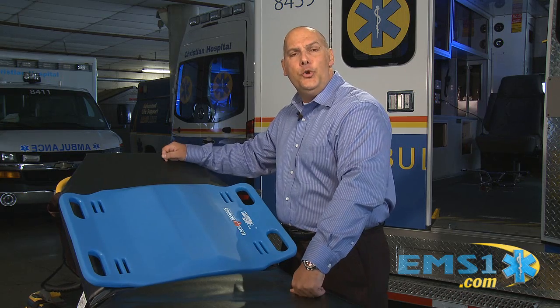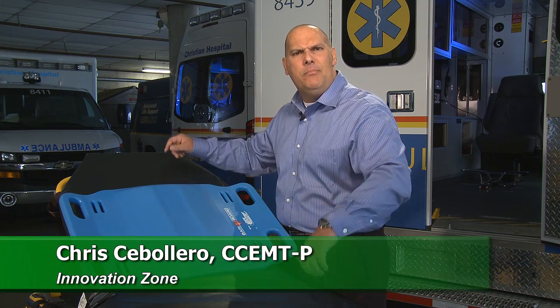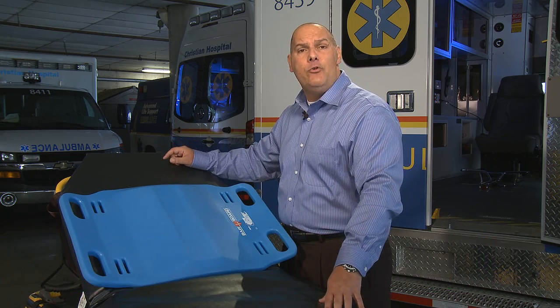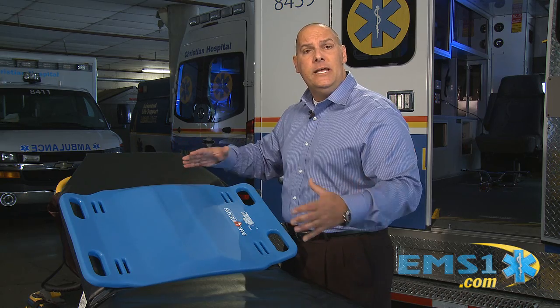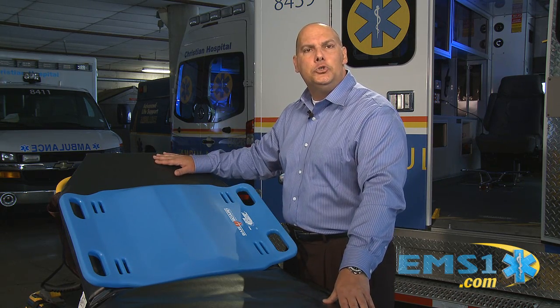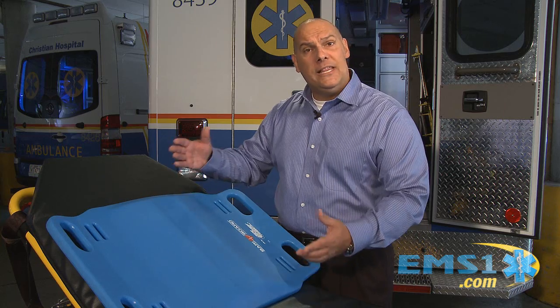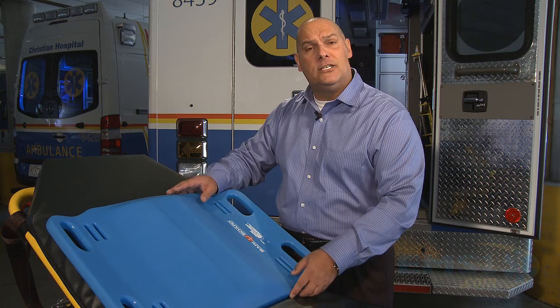You know, they say that almost 2/3 of the U.S. population is either overweight or obese. And think how problematic that could be when we need to do CPR. You know, they say it takes about 100 pounds of force to do effective CPR. But as the patient gets bigger and the surface area gets larger, it's a little bit more difficult to get those good chest compressions.